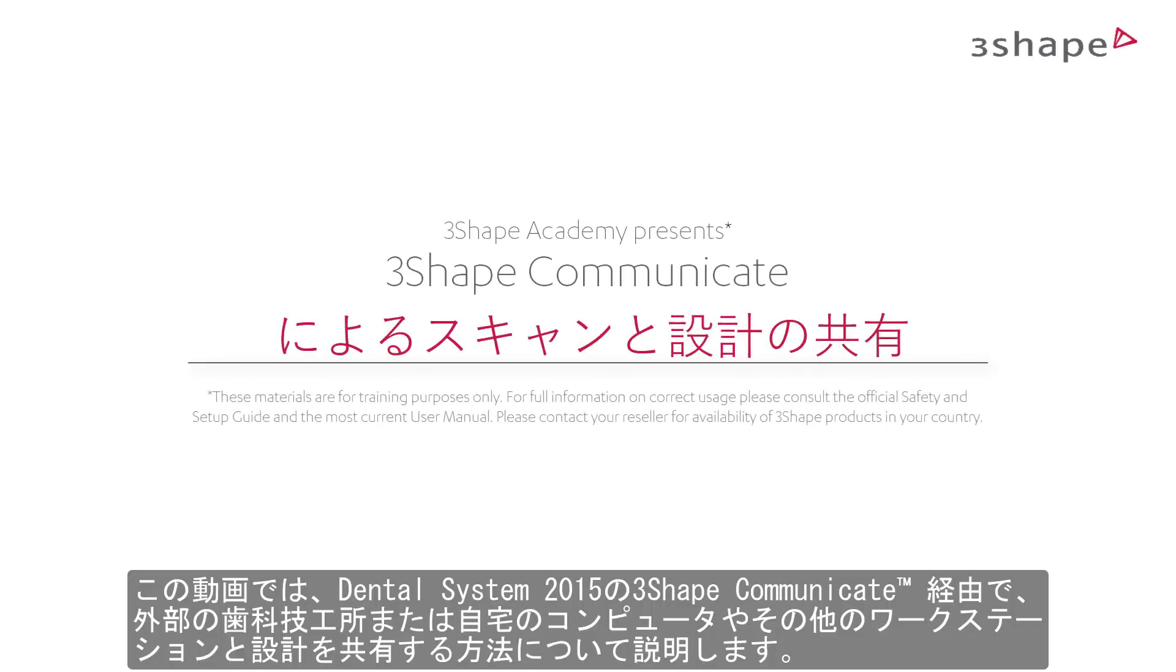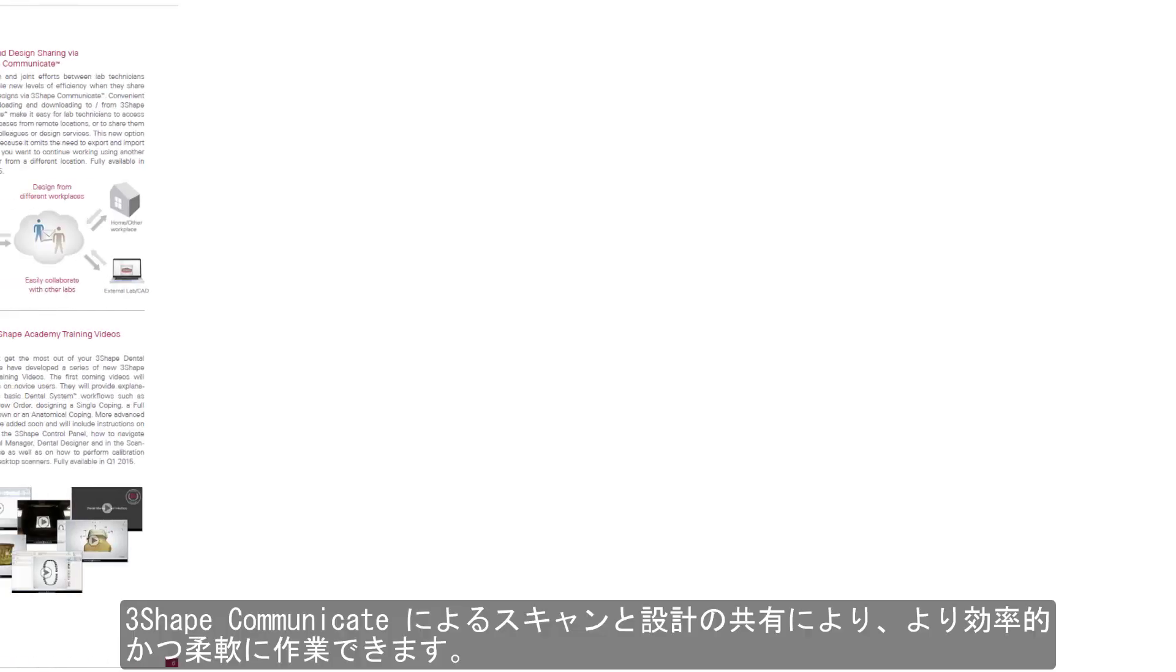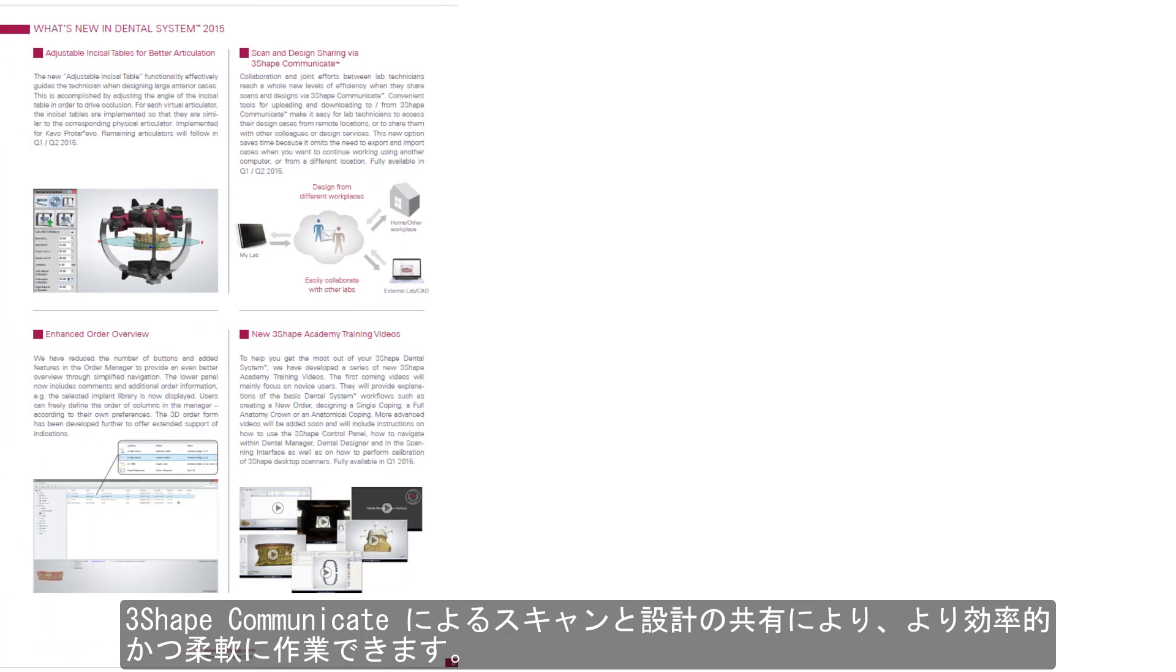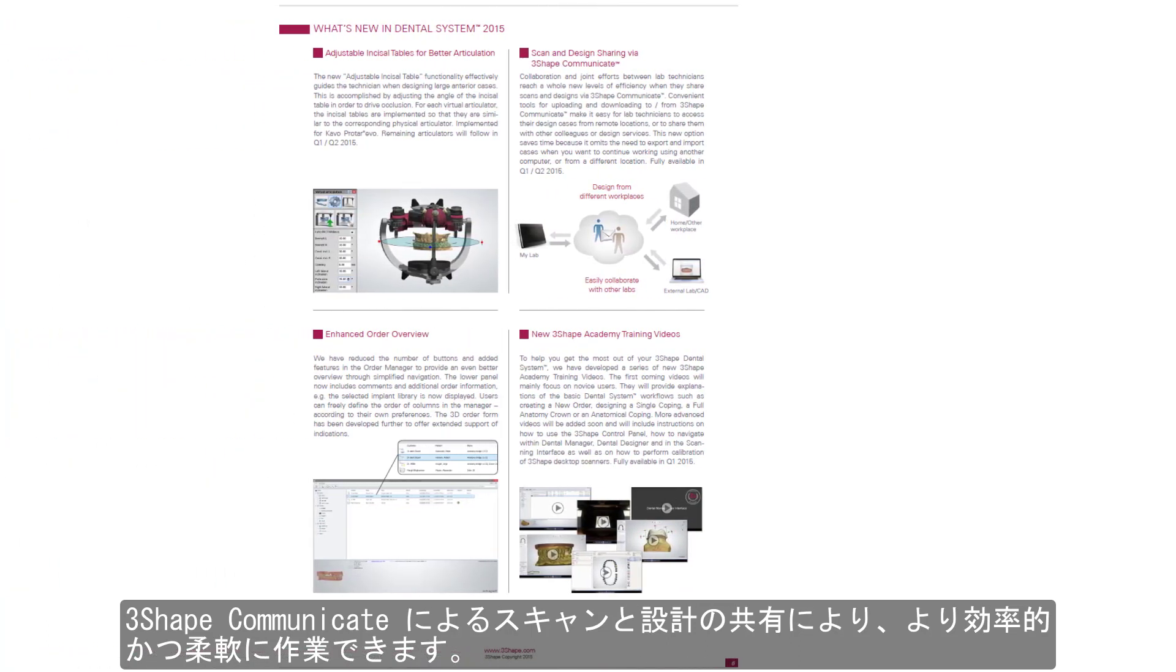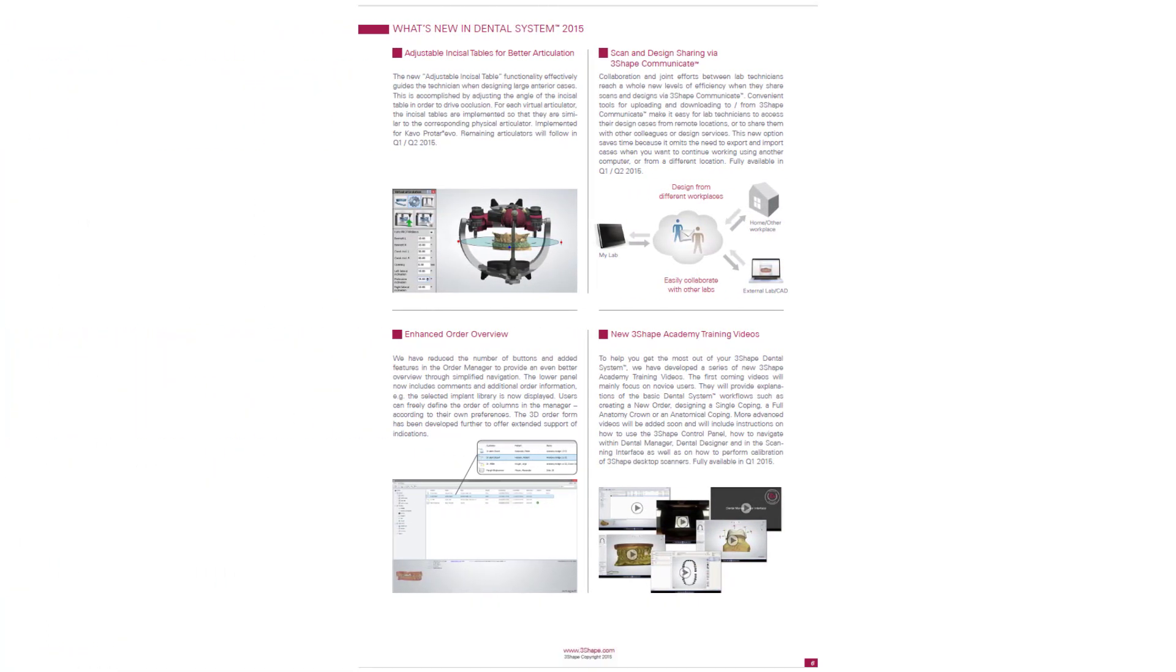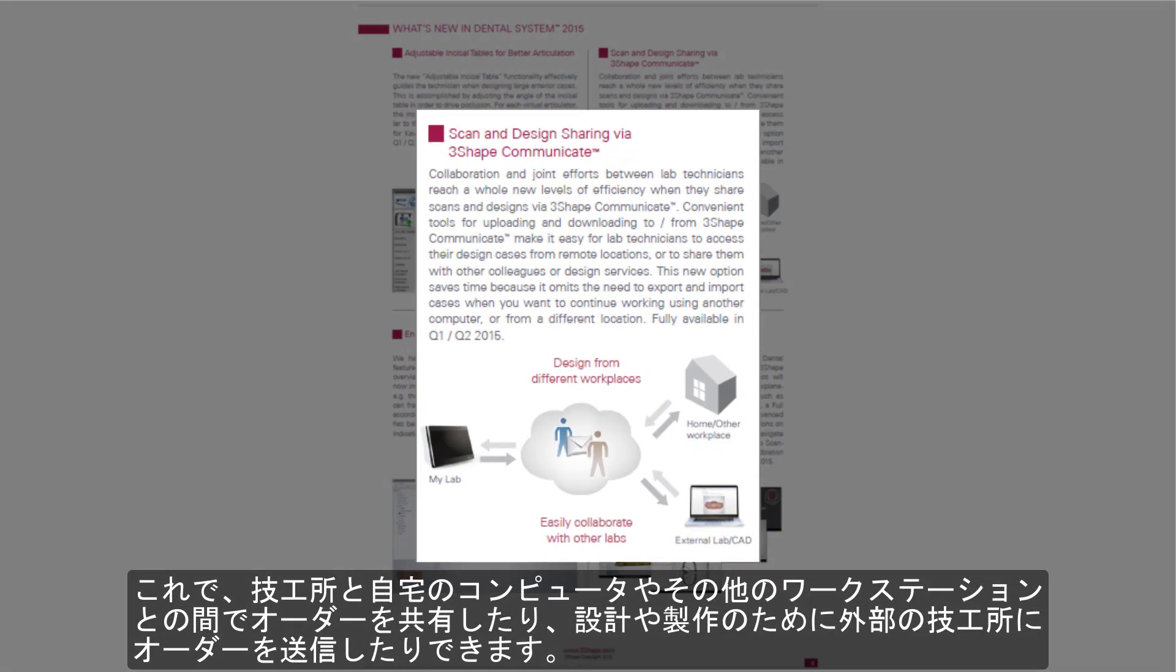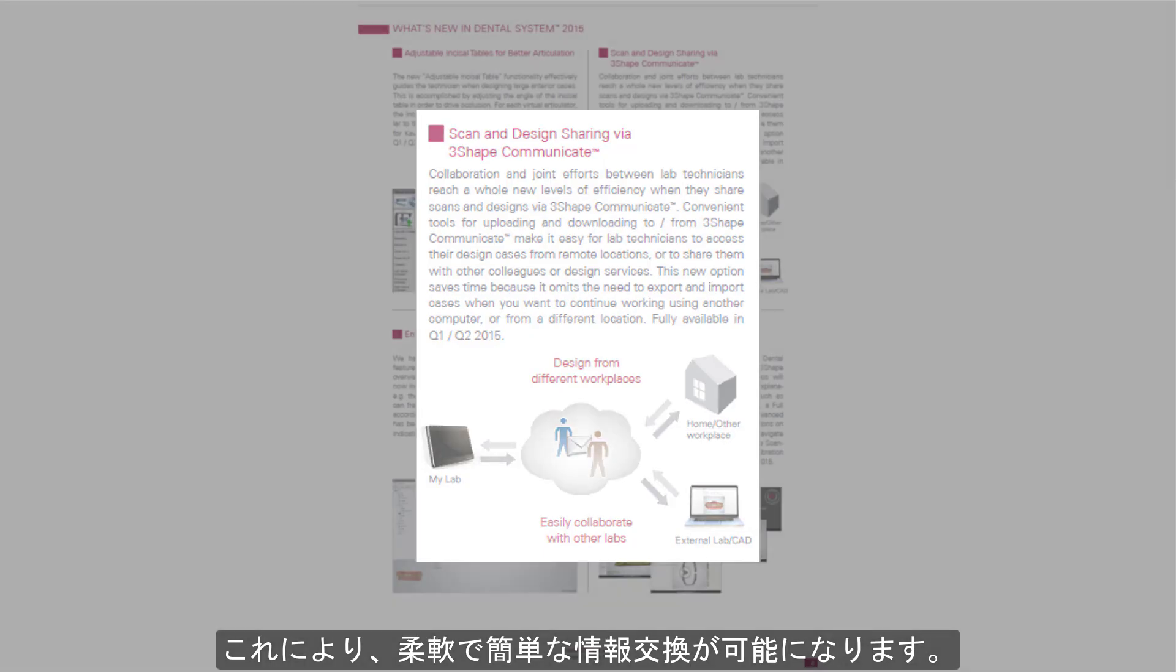In this video we will show you how to share designs with other labs and your home PC or other workplace through 3Shape Communicate with Dental System 2015. Scan and design sharing via 3Shape Communicate enables you to work more efficiently and flexibly. You are now able to send orders between your lab and your home PC or other workplace or send orders to an external lab for design or production. This caters for flexible and easy collaboration.